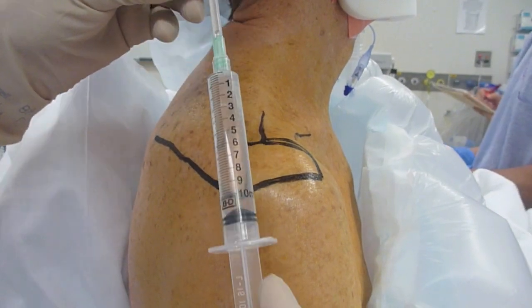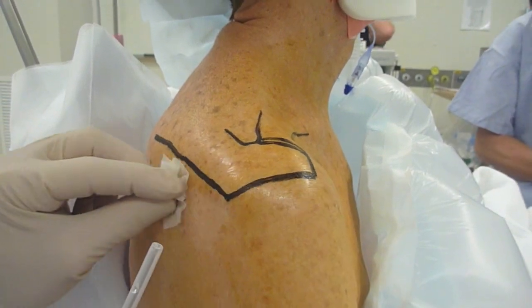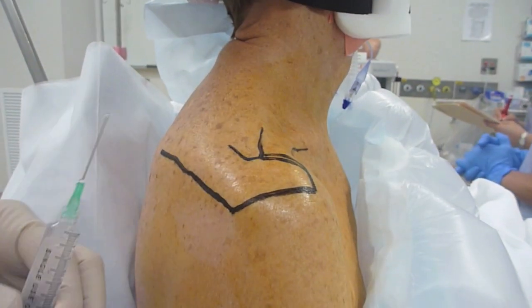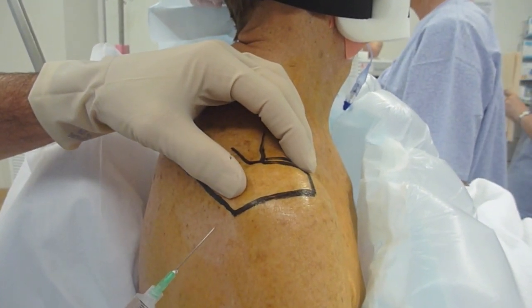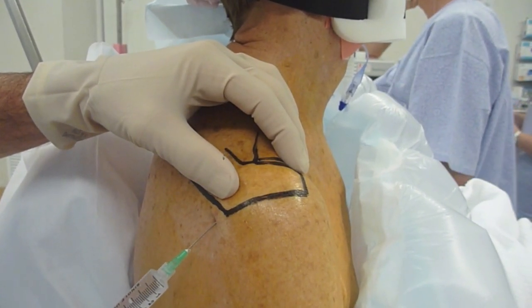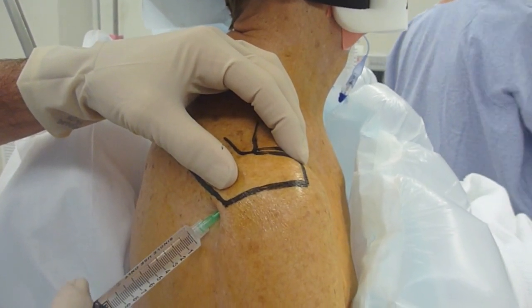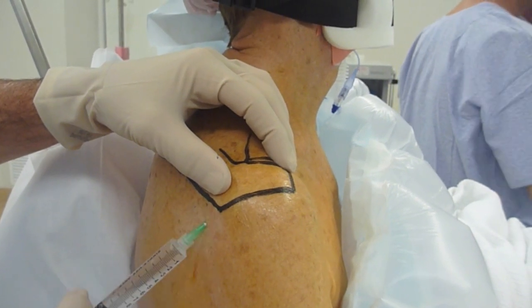Here is a patient's right shoulder looking from the side. You can see I have a 21-gauge needle. I'm using an AlcoWipe just to sterilise the skin. I'll palpate the posterior aspect of the acromion with my thumb and aim to bring the needle in from well below it. There I am hitting the bone of the posterior acromion and now sliding forward underneath the acromion — so long as I've done that, I know I'm in the right space.